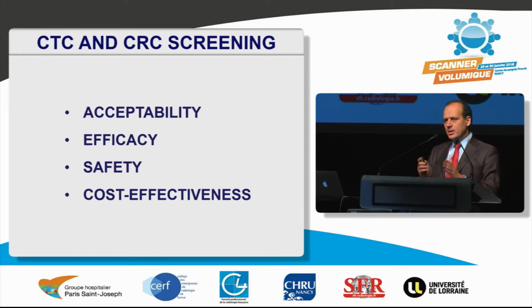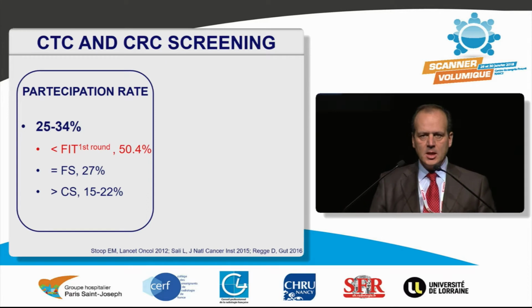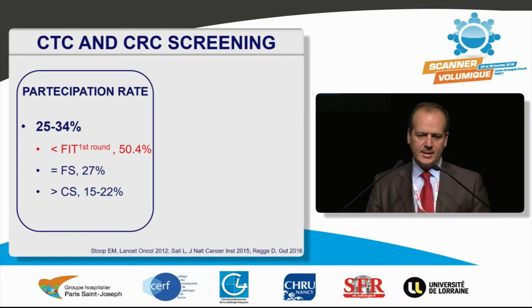Of course, CT colonography needs to fulfill those 4 criteria, which are the leading criteria for a test to be acceptable as a screening test. So first of all, acceptability and efficacy. If we offer the test for free, how many people would attend the test?